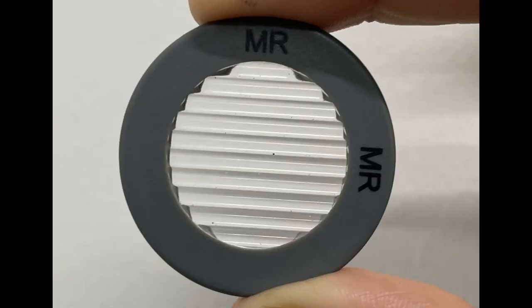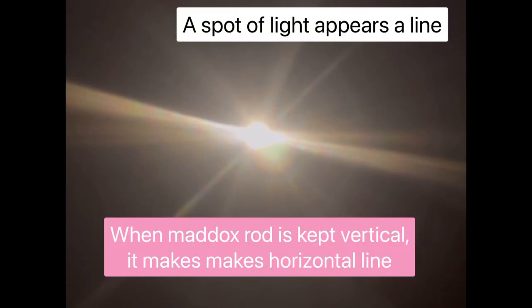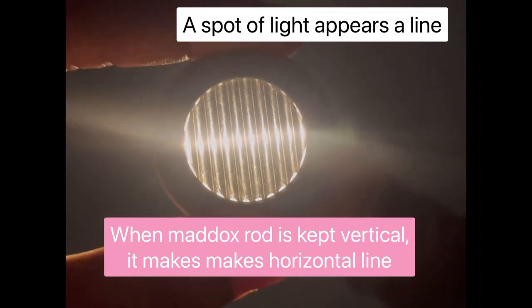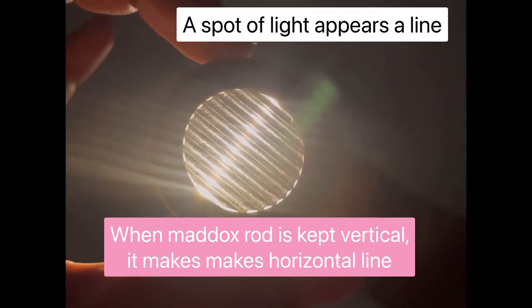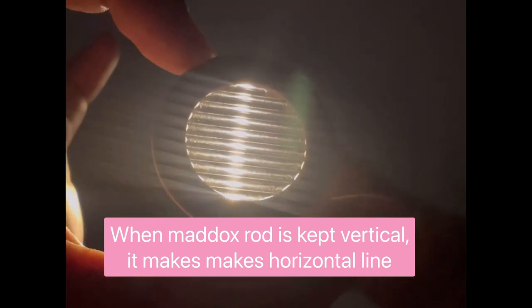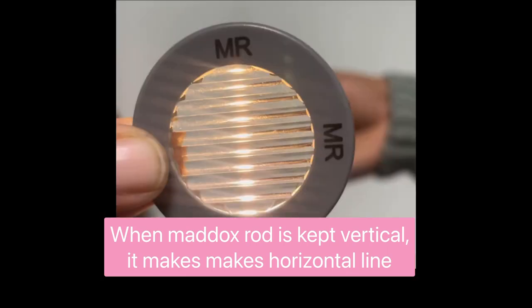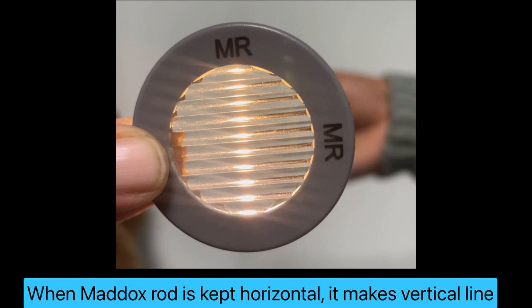Please remember that Maddox rod contains parallel plano-convex lenses which reflects light rays so that a point source of light appears as a line or streak of light. And this line is seen perpendicular to the axis of the cylinder. When Maddox rod is kept vertical, it makes horizontal line, and when it is kept horizontal, it will make a vertical line which you can see clearly in this picture.